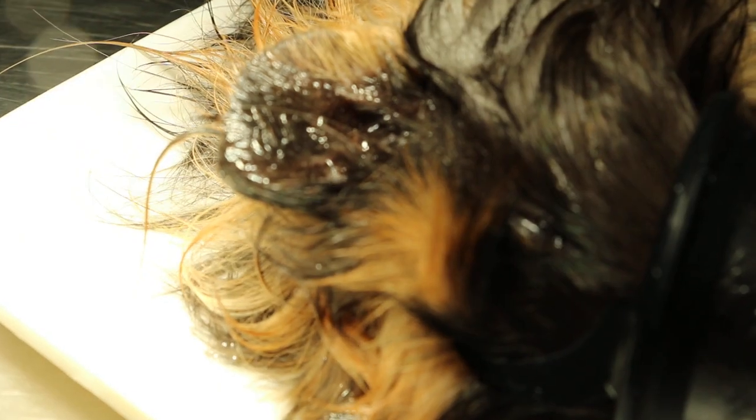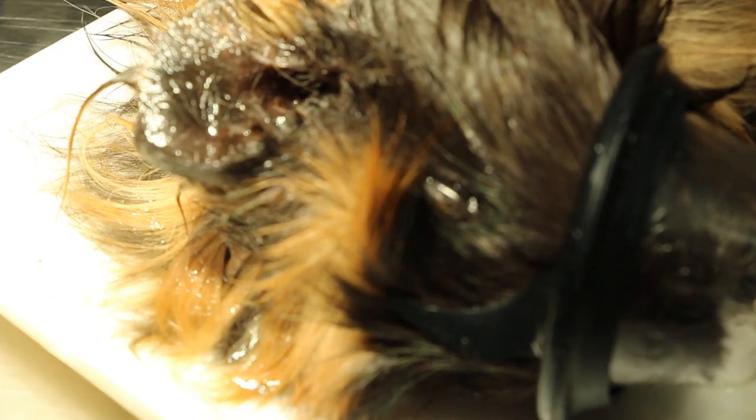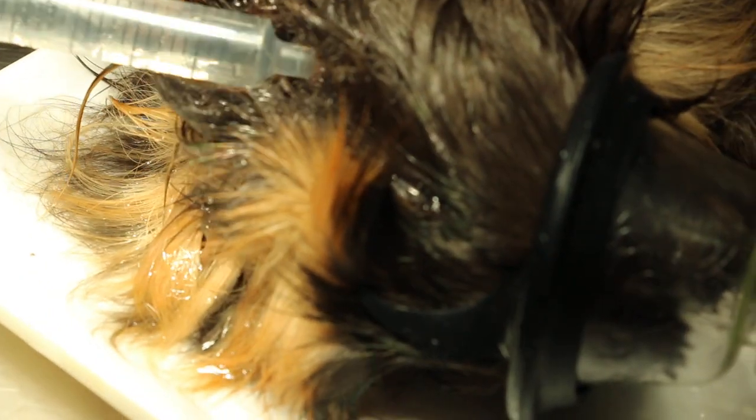The owner came in for a right head tilt. So this gives access to the canal — just how I check. There's no ulcers on the scope, but there is very dirty black discharge and painful ears on palpation of the ears.